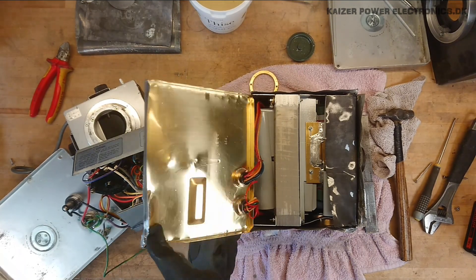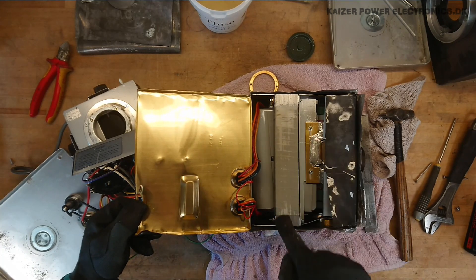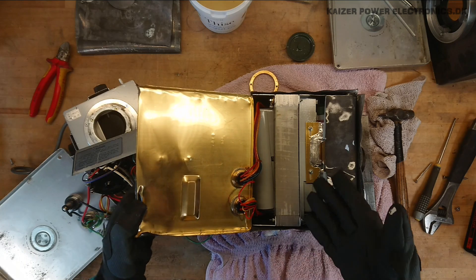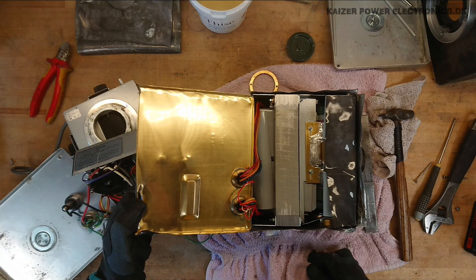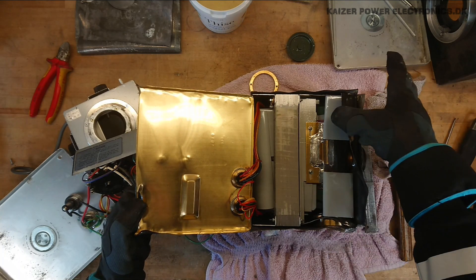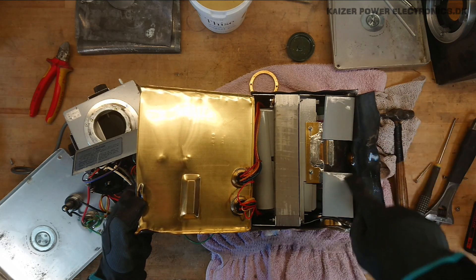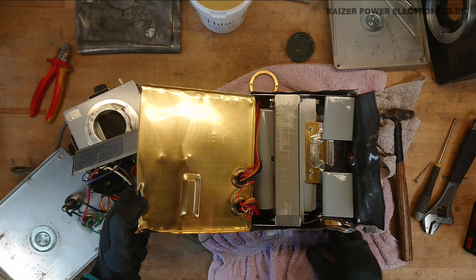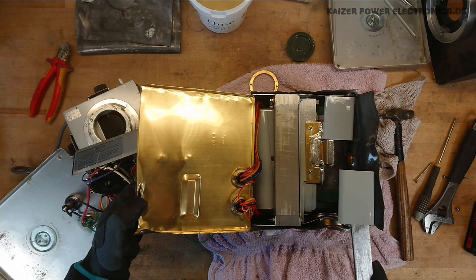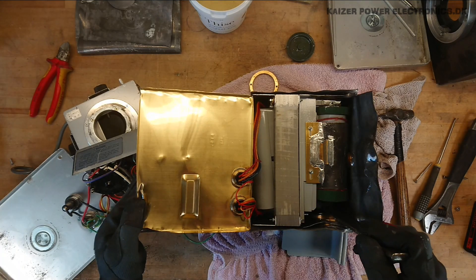Here we are, and here we have it. A nice big iron core transformer — as this is mains driven, it's of course a mains frequency transformer sitting here. Some more lead shielding, also down around the x-ray tube that we have here. Some kind of plastic holders just keeping it in place. Some more plastic down underneath here.